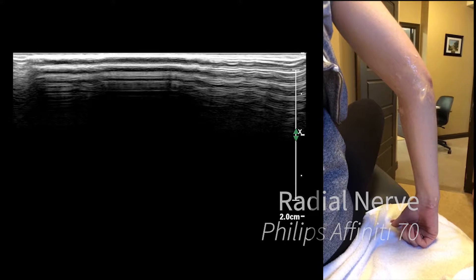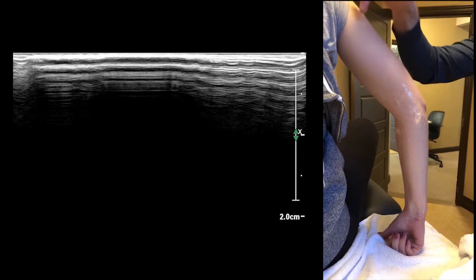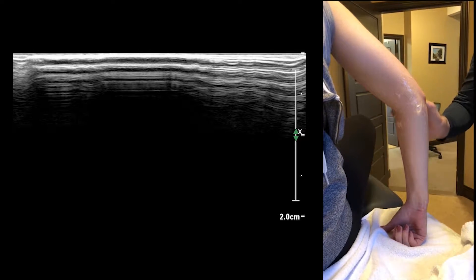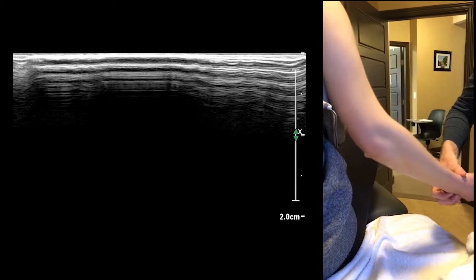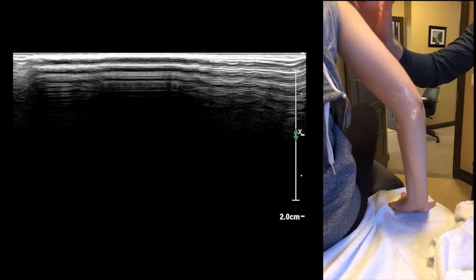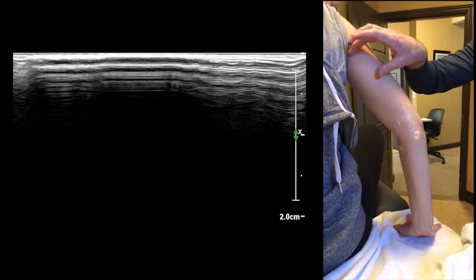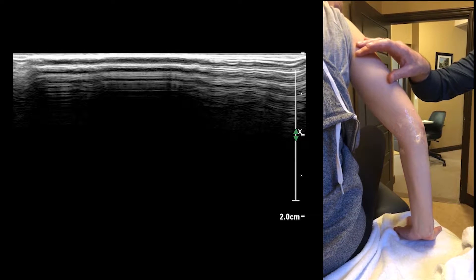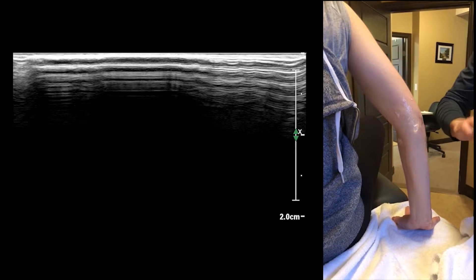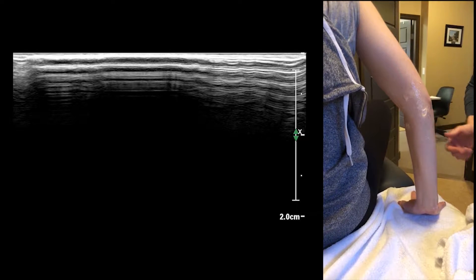With this next one we're going to do the radial nerve. I like to have the individual sitting, and the reason is the radial nerve spirals around the humerus in the spiral groove, then goes anterior. You can easily rotate the hand and arm around while doing this, without having to abduct the shoulder, and you can get access posteriorly without contorting the patient. The other way is to have them lying supine and then roll into lateral decubitus position — I kind of like it sitting.